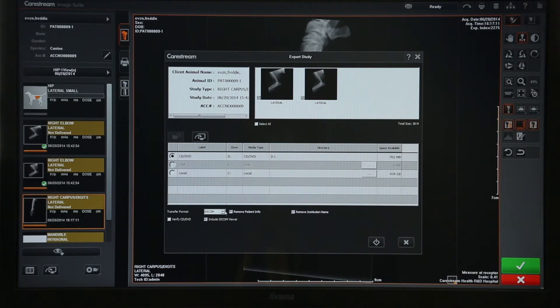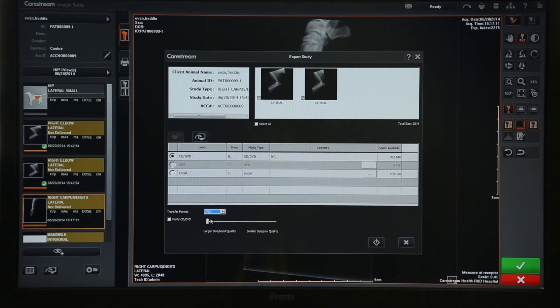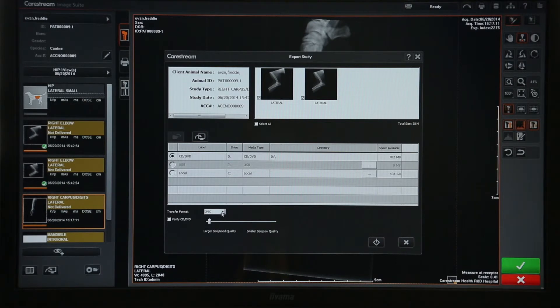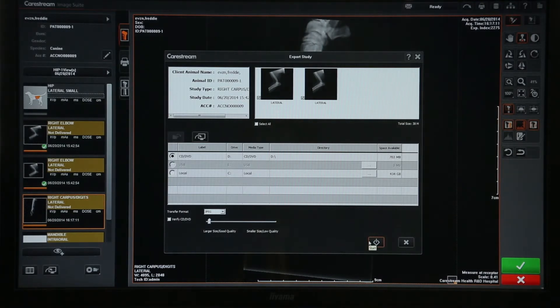You can also add a DICOM viewer, which enables people to pop the CD into their computer and view the images. Or you can choose JPEG, which is great if you're doing a presentation, and you can choose the size of these. Once you've decided what you're burning and where, just click start and it'll begin burning. If there are a lot of pictures this may take a little while because it's a big file and can take a few minutes to burn.